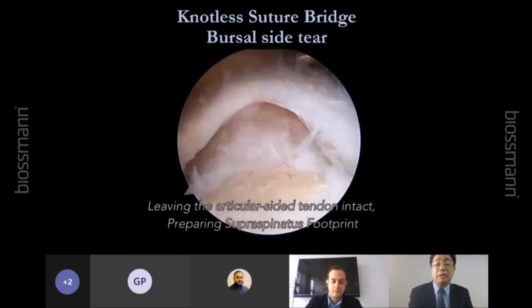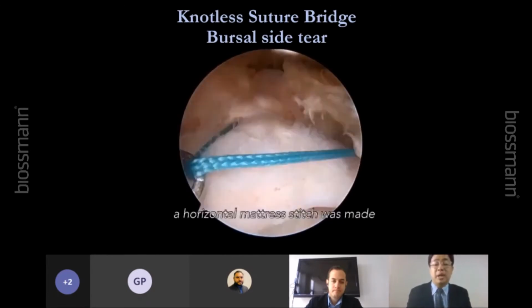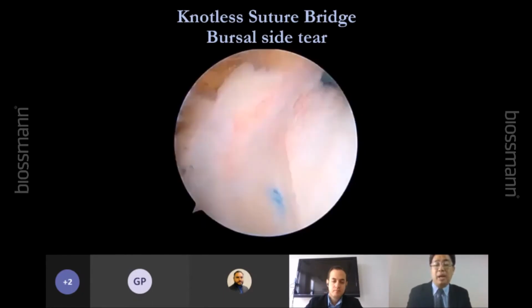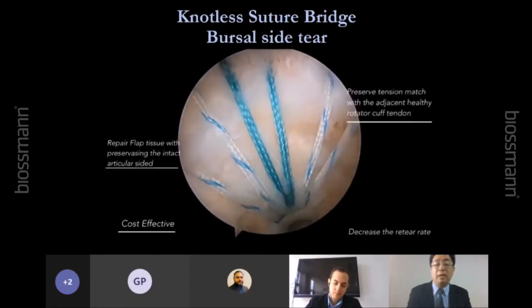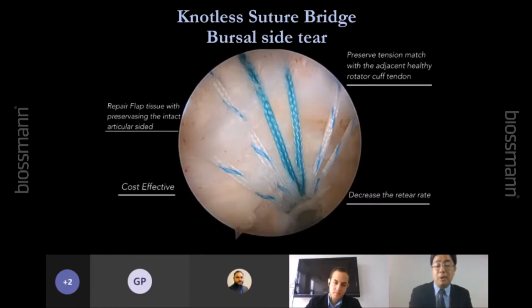So sometimes we can do the knotless suture bridge technique, like for the bursal side tear. I try to preserve my articular side, okay, by making just the bursal side and then doing the knotless, right? We do it like a parachute, right? This is using only one lateral row. You can reduce the bursal side tear, right? So this is quite simple, and also has good results using this knotless suture bridge for the bursal side tear.